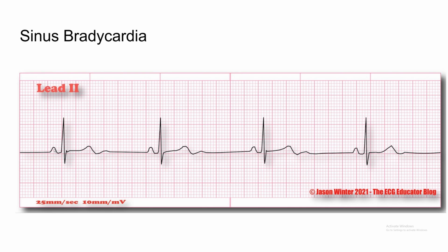PRI is fine. There's still a P wave here. QRS is normal. We know that the electrical impulse is still coming from the SA node, right? The only difference is the impulses are coming at a much slower rate. And potential causes of sinus bradycardia are things that would cause the SA node to have some sort of dysfunction or to slow down. And these causes would look like drug overdoses, like beta blocker overdose or any nodal blocker overdose, or you maybe just take one too many of your daily beta blocker, like you took an extra propranolol because you couldn't remember, that type of thing.